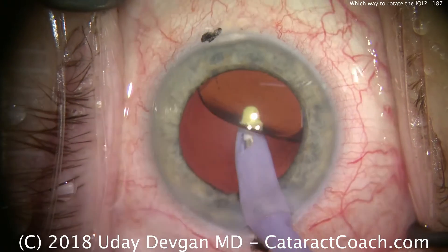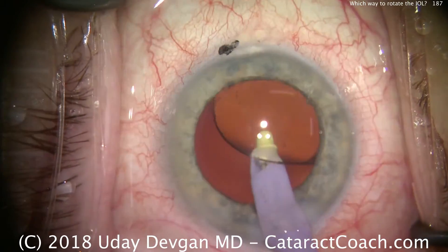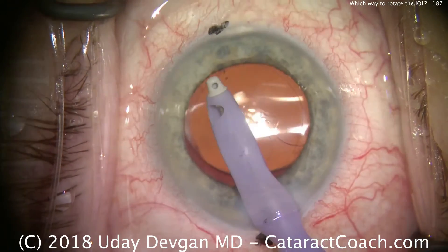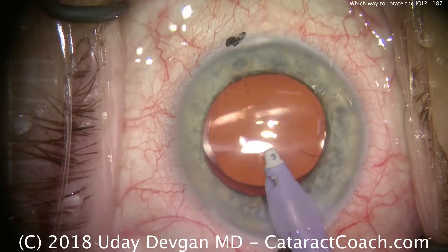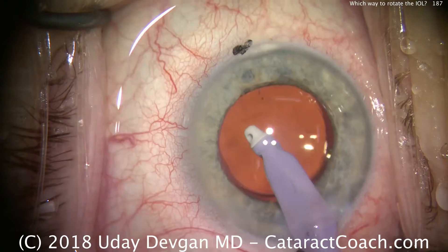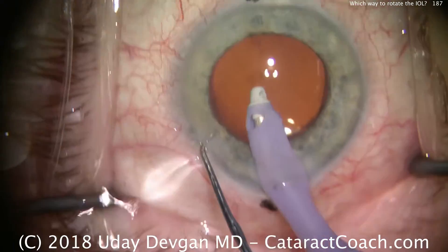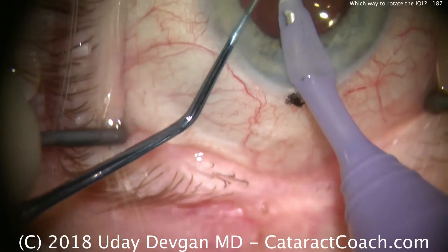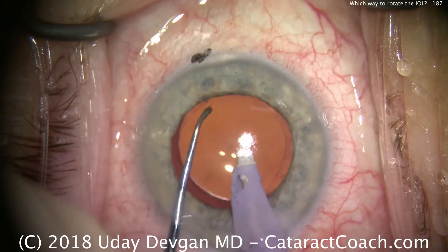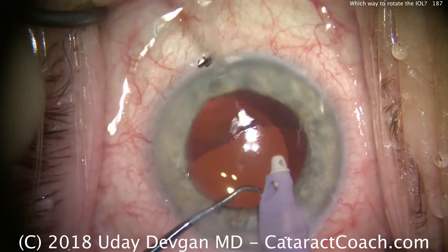So now, removing viscoelastic, we're going to end up collapsing the capsular bag down, and the lens at this point will best rotate in the clockwise direction. And if you look carefully on the corner, you see the marks where I'm going to try to align this lens. I initially rotated counterclockwise while the haptics were unfolded to go beyond those marks, and now I can just nudge the lens clockwise.